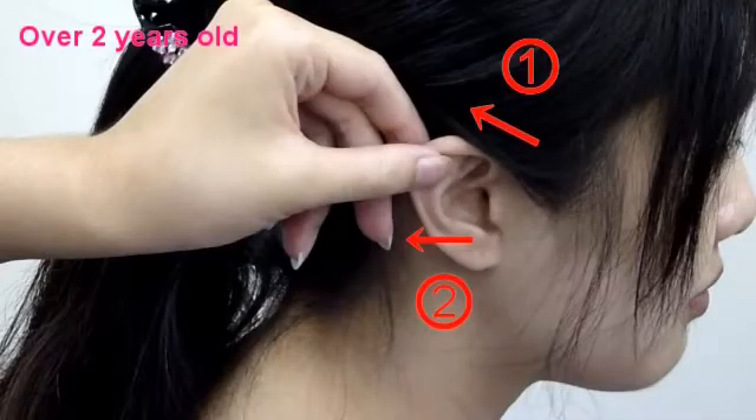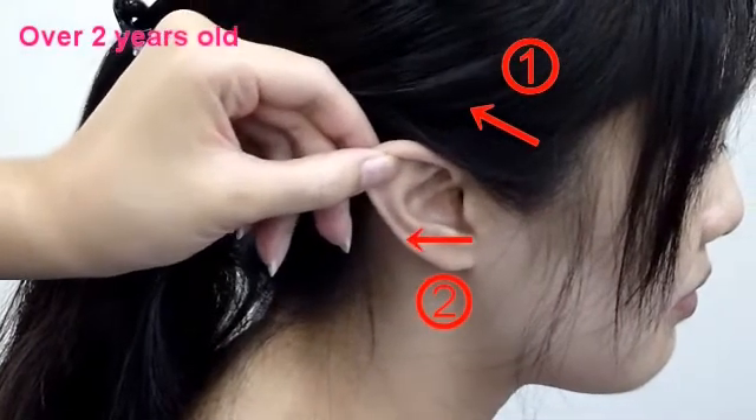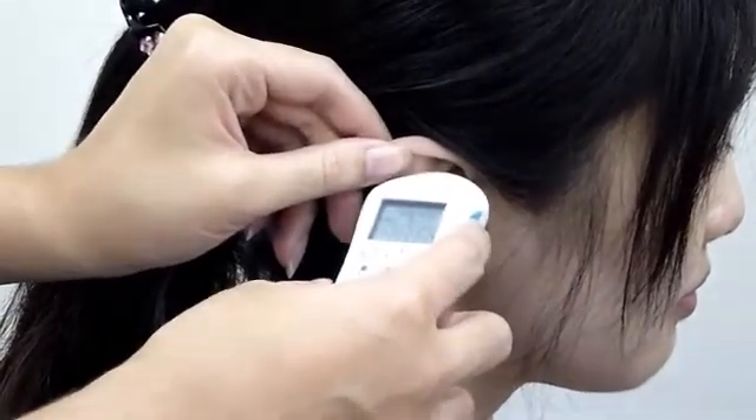For children over 2 years old: pull the ear up and backward, then put the probe into the ear canal.